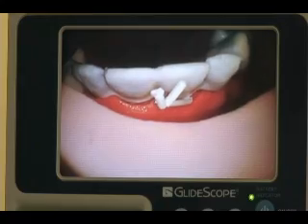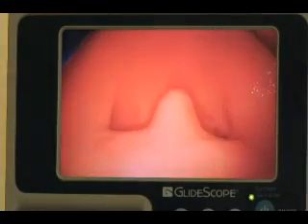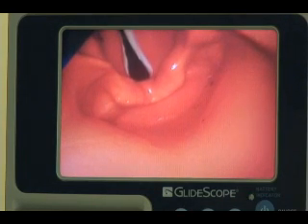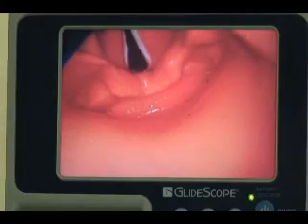So you would insert the laryngoscope midline. Okay? You can see the teeth. Okay? As you go back, glottis. So I insert it into the vallecula. You're going to just lift straight up. Now you have direct visualization.